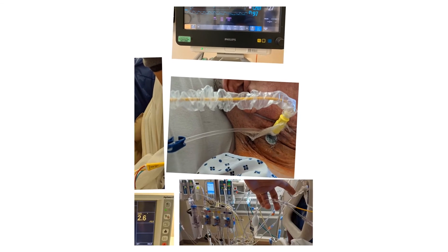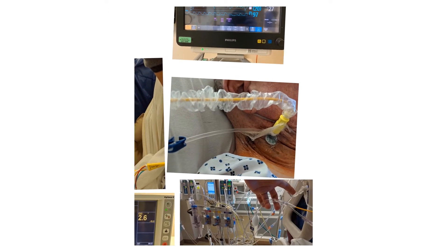This is a picture of a patient that has a Swan. As you notice, this is a Cordis — if you watched the central venous catheters videos, we talked about large-bore catheters. The Cordis is here, and this is the port to the Cordis. It's a large-bore catheter, and we insert the pulmonary artery catheter through the Cordis all the way into the pulmonary artery.